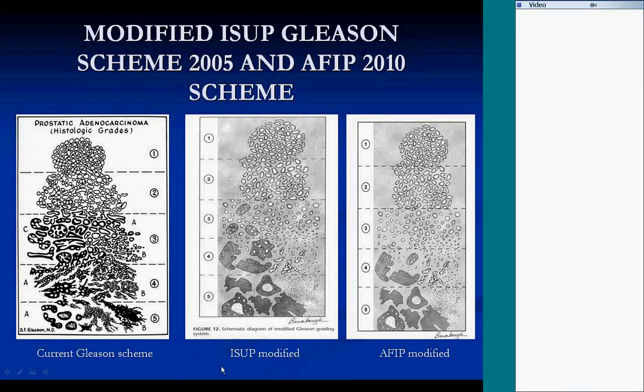So when we write about the Gleason grading in our CAP protocol, what we mean is that one should apply a Gleason grading scheme as you see it illustrated in this most recent diagram on the far right.